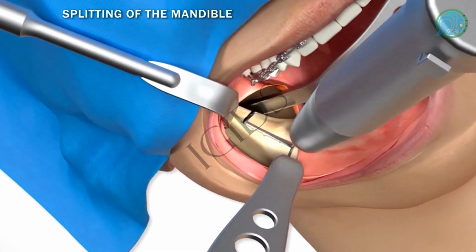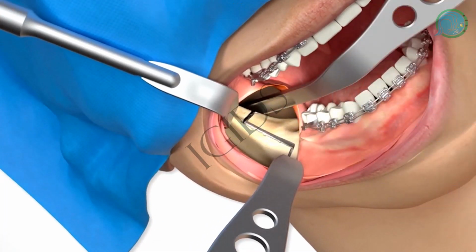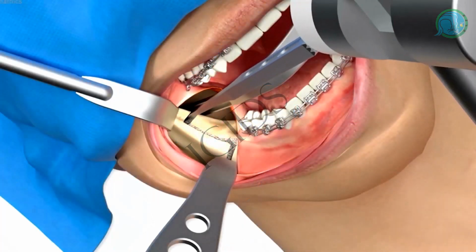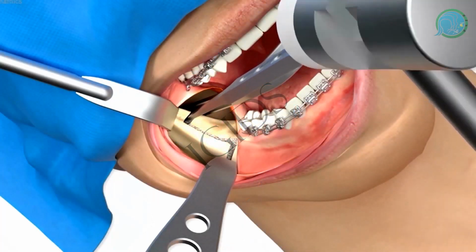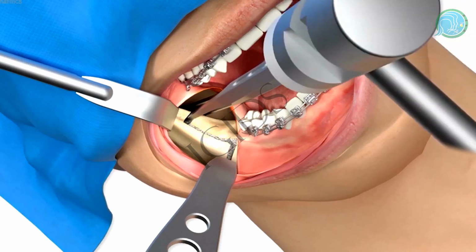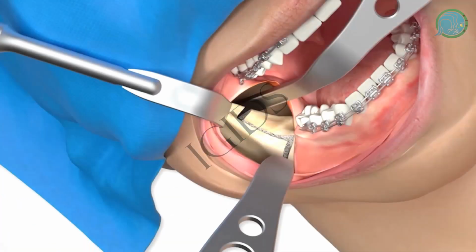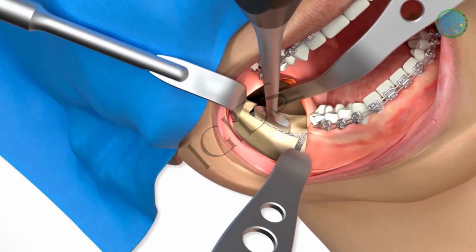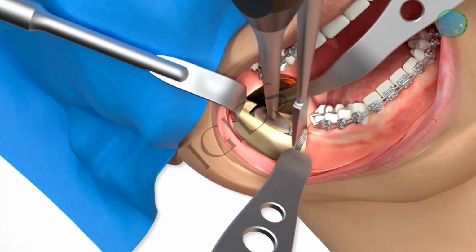With a 6 mm spatula osteotome, complete the osteotomy beginning at the medial cut of the inner cortex of the ascending ramus to initiate the splitting of the buccal cortex from the lingual cortex. All the contents of the inferior alveolar canal should be separated from their buccal attachments, and the nerve and the vessels should be allowed to fall medially.